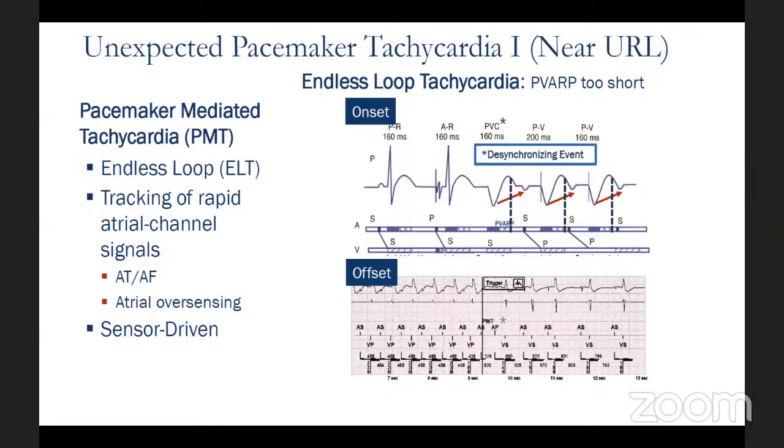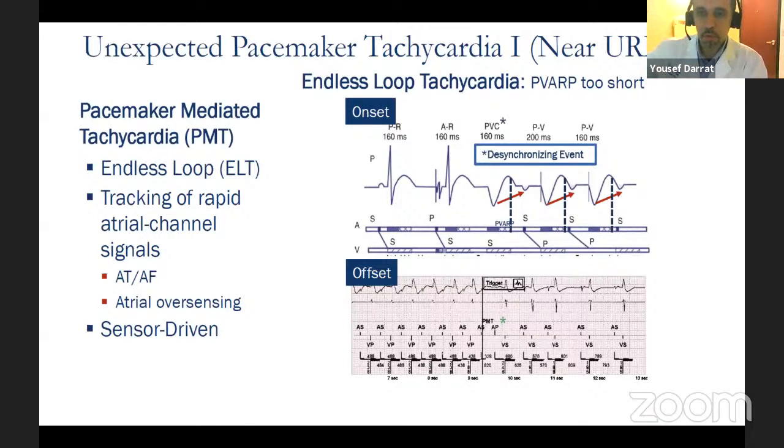Yusuf, what's the difference between the tip of an abandoned lead and a tip that's still hooked up to a pacemaker or a device? That's a closed circuit because you're connected to the battery, connected to the pulse generator. So it's a closed circuit. But if you have an abandoned lead, it's like a piece of metal in the pocket there. Yusuf, then the tip. Just to counter this argument, for example, let's say that you have a leadless pacemaker. Yeah, with a leadless pacemaker, you could do an MRI.